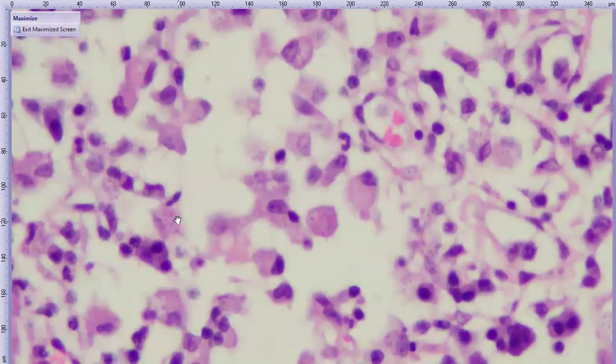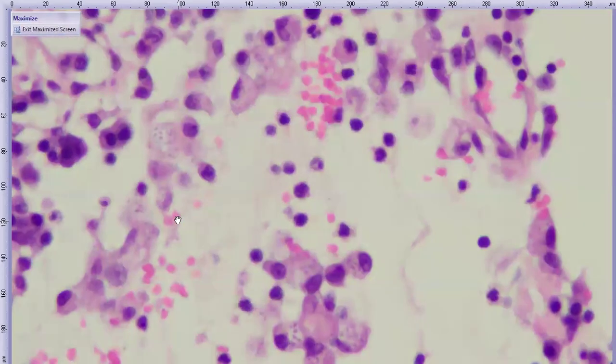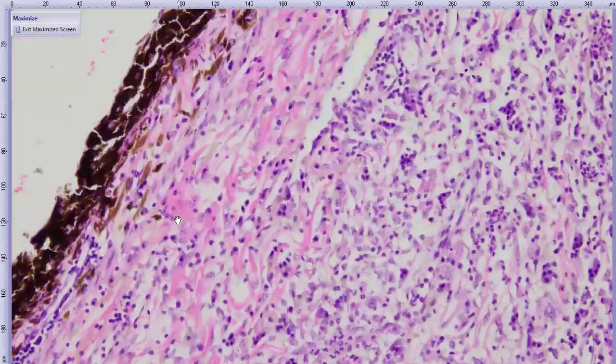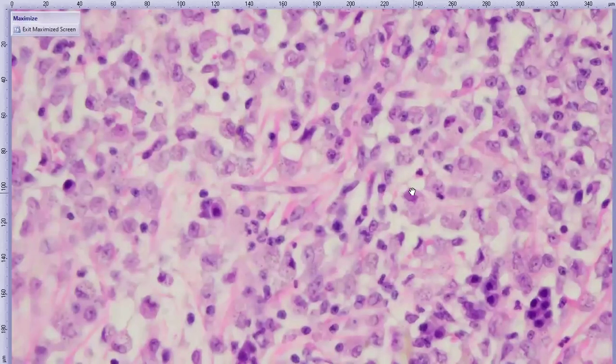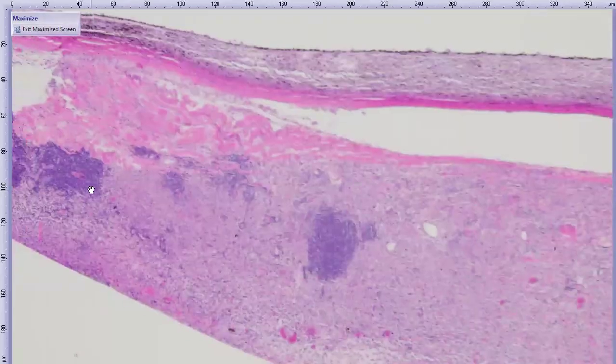I can scroll around just to show how many there are. They're virtually in all of the macrophages. Target-rich environment. Drop anywhere. This is a nice, easy one. There's very little searching to be done. Here we are in the iris stroma, with all of these macrophages. Do you want me to keep showing you? It's just going to be more organisms as we go around.